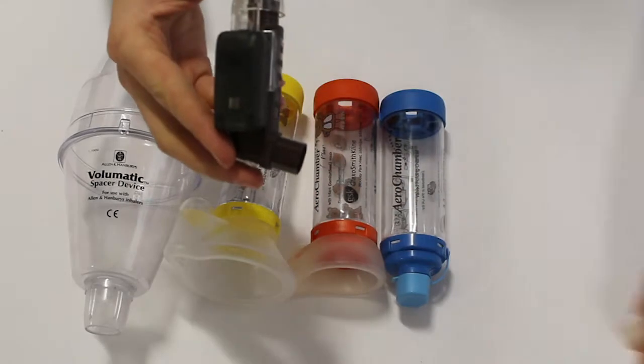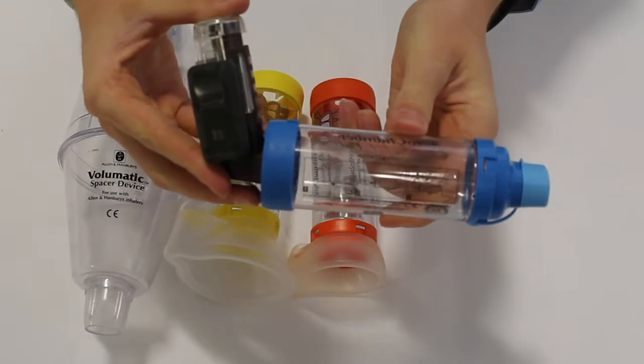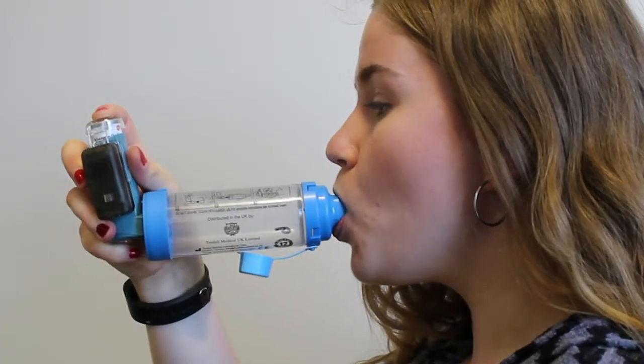Attach a spacer to the mouthpiece, taking the cover off first. The spacer should be inserted behind the teeth with the lips sealed tightly around it.